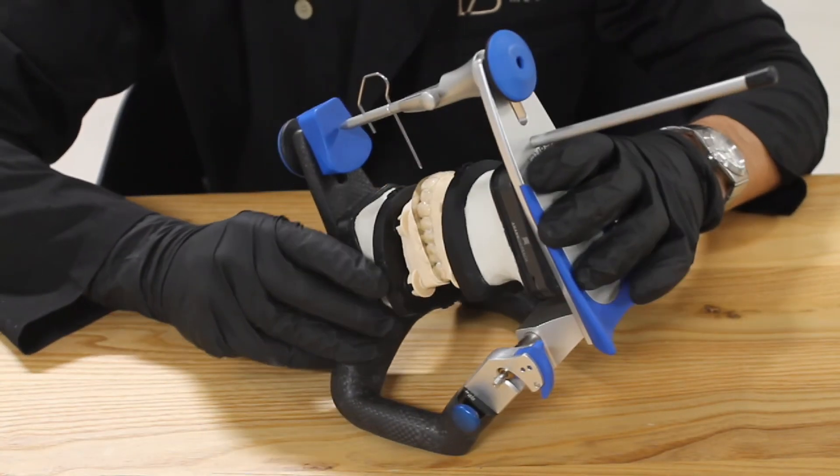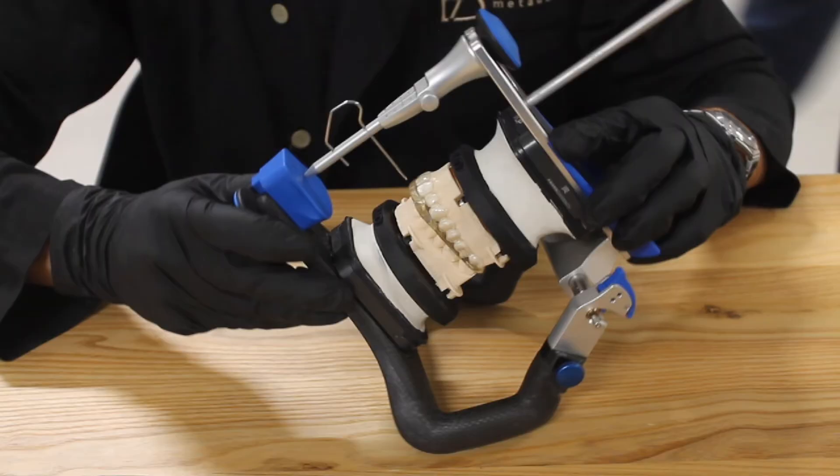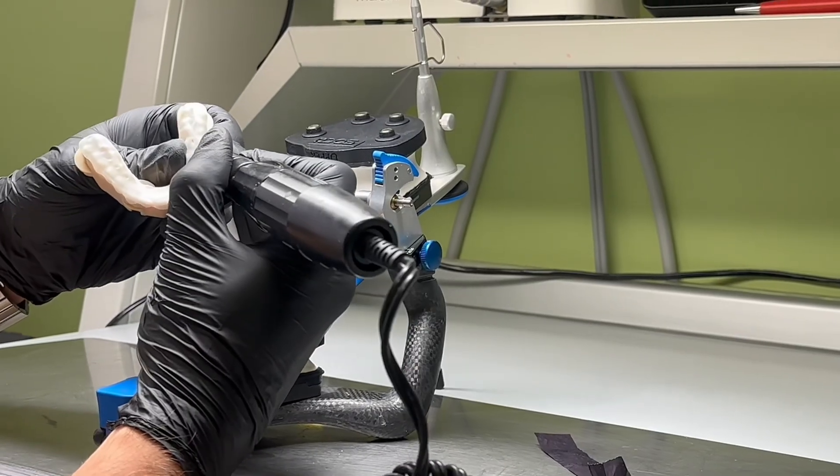Once the models are positioned in the articulator, you can proceed with a classic traditional occlusal check and finalize your restoration.